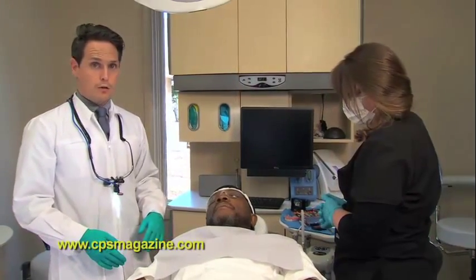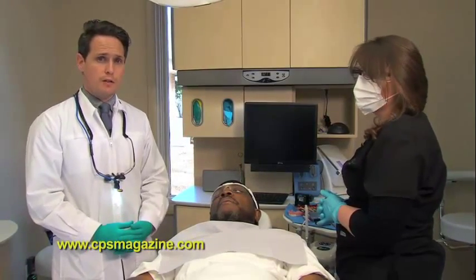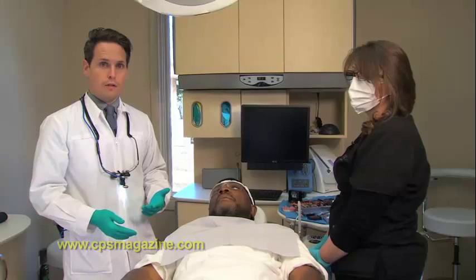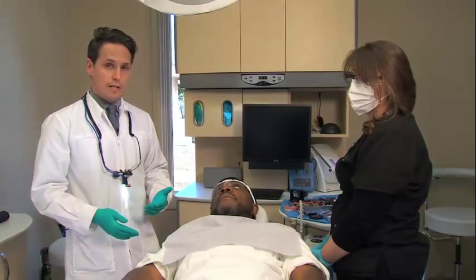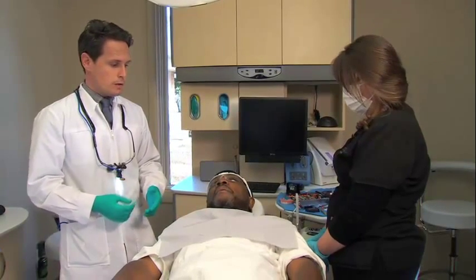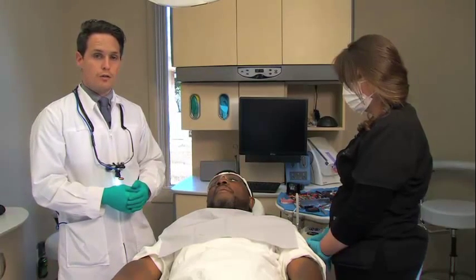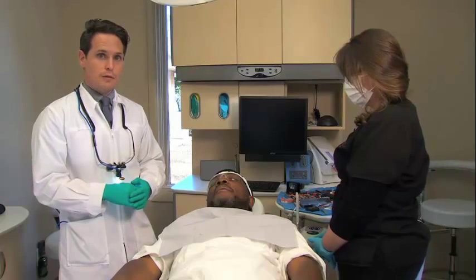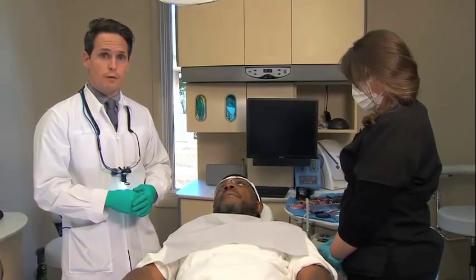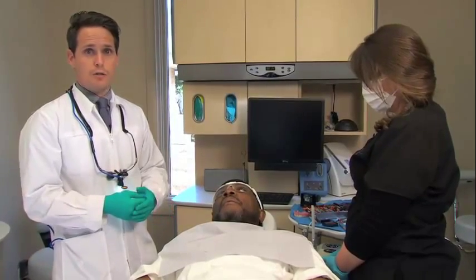We have Byron here who has been in a denture for approximately six months and his implants have integrated. We've done some of the preliminary steps before getting in here, including placing the locator attachments and torquing them down to the specified manufacturer's instructions. We've also relieved the denture for the locators by placing a Thompson stick on top of the attachments and relieving in the specified areas. Your laboratory can also do that for you, but this saves us a step when using the VOCO products.